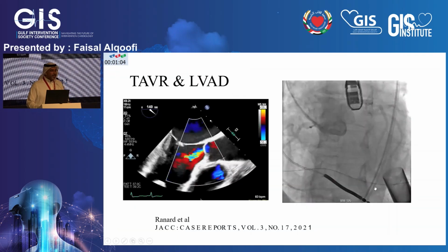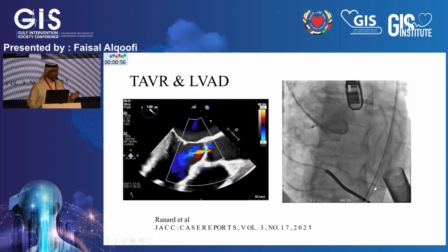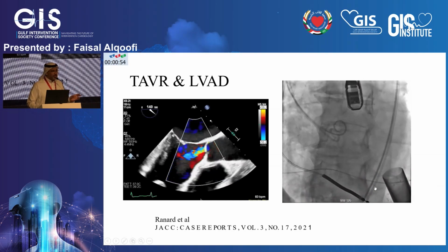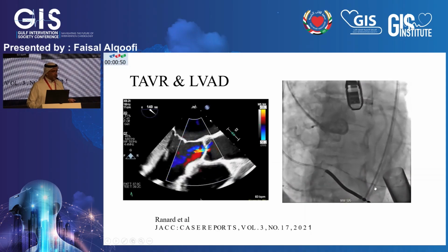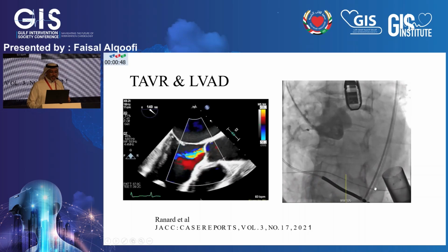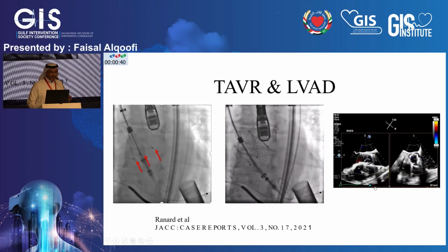So this is a neat case published in JACC, where they are doing TAVI in LVAD. This is a niche that you're going to see in the future for certain centers which deal with TAVI. AI is a significant complication for patients with prolonged LVAD. This is a nice case where they've used a special platform. This valve is currently, or soon will be, approved for this indication, which is pure AI, the JenaValve.